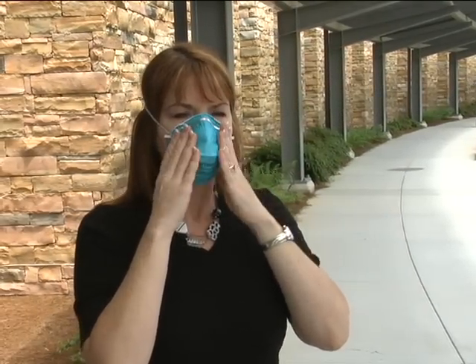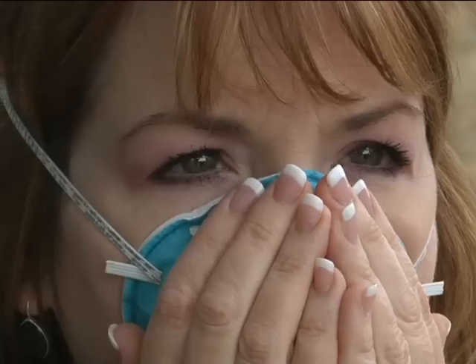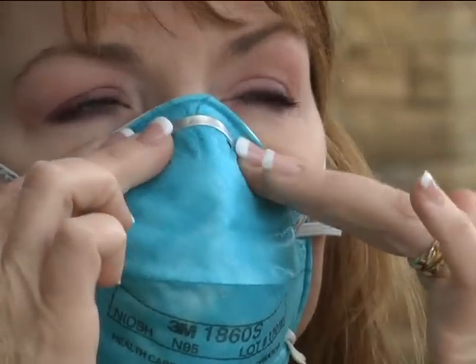Make sure that your mouth and nose are covered by the respirator. If the nosepiece has a metal nose strip, use both hands to mold the nose strip to the shape of your nose. Next, check the seal of the respirator on your face.